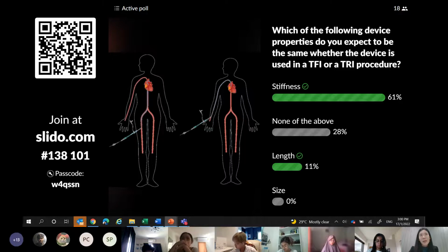As we mentioned, femoral access is actually the traditional access site. Typically, that's what they use from the very early days of angiogram and angioplasty. But when we transit to the arm, it's actually not very difficult because the length is the same.